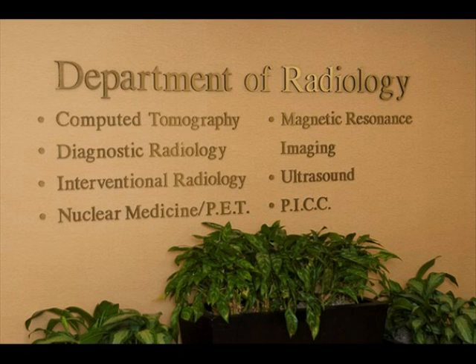The patient will be scheduled a date and time for their exam in a radiology department. This could be an outpatient clinic or a hospital. Upon arriving to the clinic or hospital, the patient will be checked in and the technologist will be informed of their arrival. The doctor's orders must arrive prior to the patient's exam or be brought with them. The technologist must view the orders themselves to ensure the correct procedure is being done.